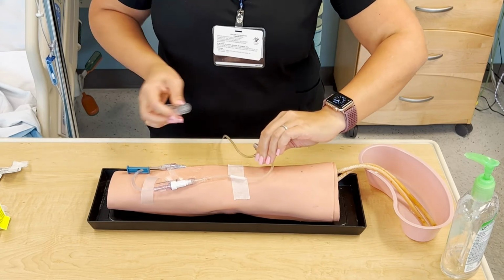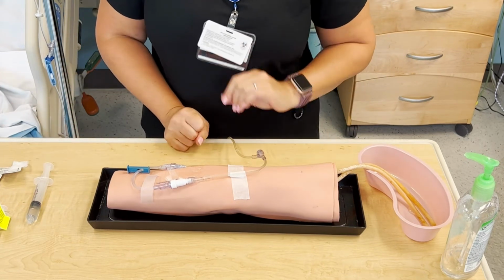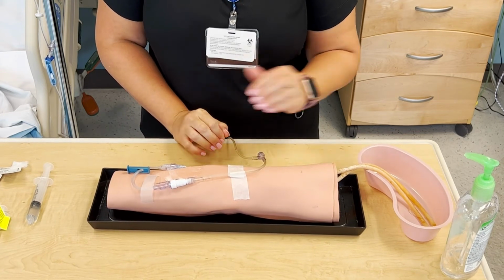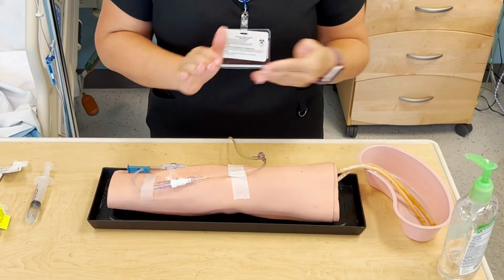Assess how your patient feels. Make sure that that IV site still feels fine. There's no signs of inflammation or phlebitis. Wash your hands and document.